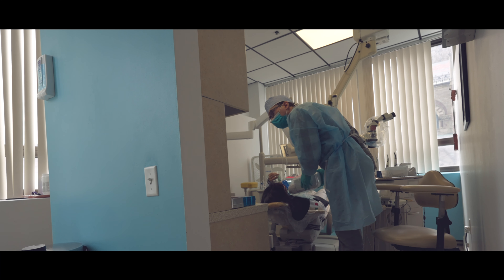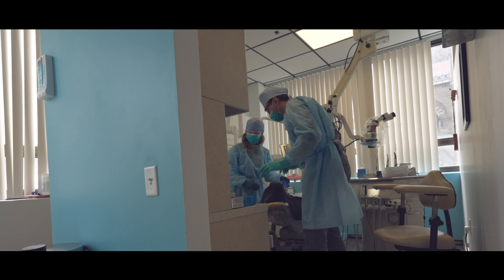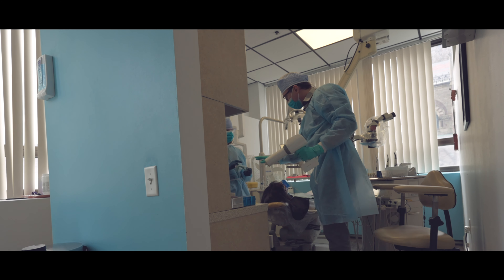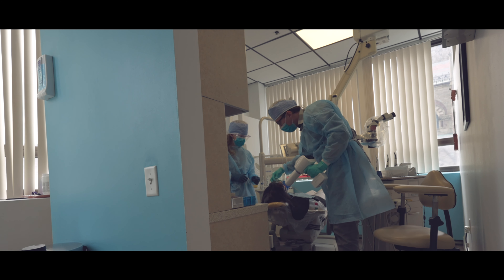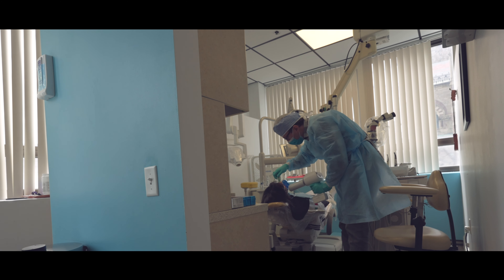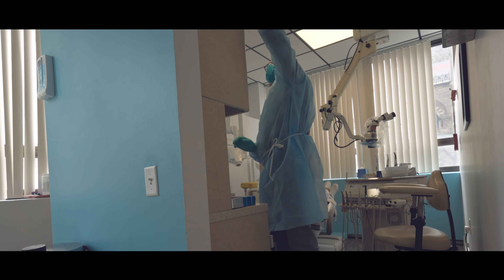When would you need a portable setting for an x-ray head? If you are interested in sharing one x-ray unit across multiple operatories instead of having a separate unit in each operatory, that's one way. If you're doing mobile dentistry and going to different places, it's great for endodontics as well because it's very quick — you can just pick it up, especially since you're shooting one x-ray at a time. And for patients that are gaggers, you don't have to put that in and wait and go outside the room to press the button, so it's a much quicker way of taking the radiograph for these patients.